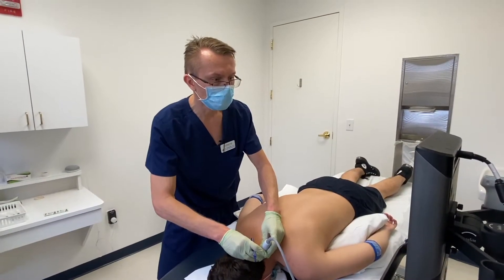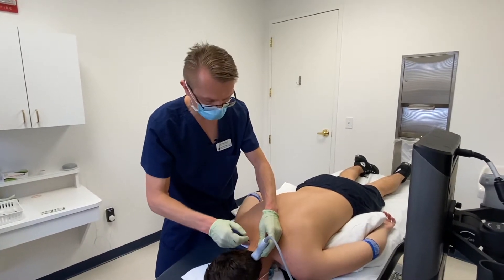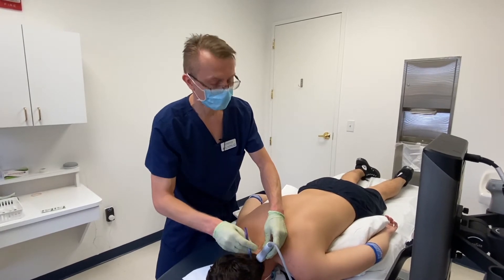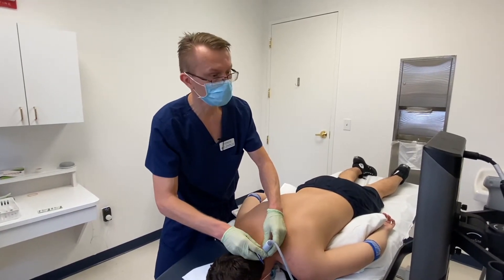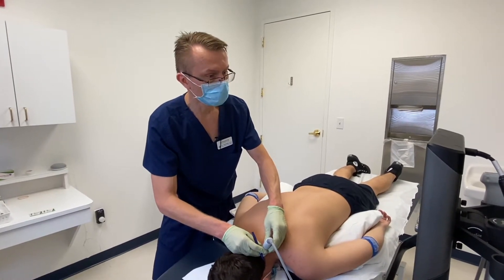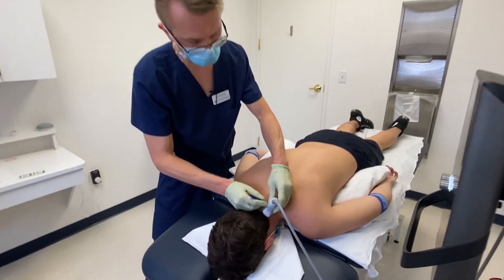What I'm doing now is just marking the landmarks with the ultrasound, making sure that we find all the facet joints that we're identifying on his x-ray as hypermobile. I'm going to put a mark on him, and then we'll anesthetize him and go ahead and do the injections.